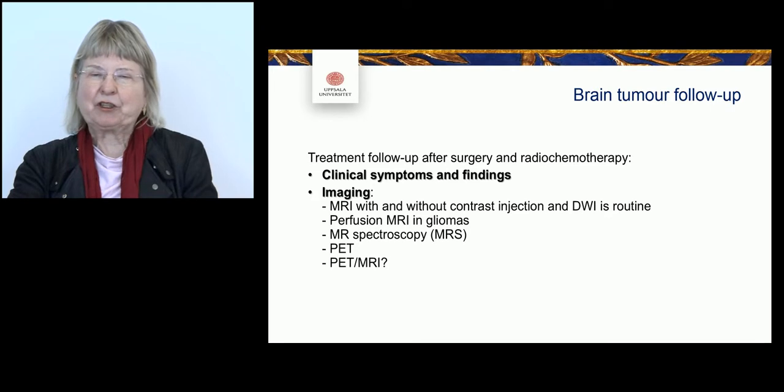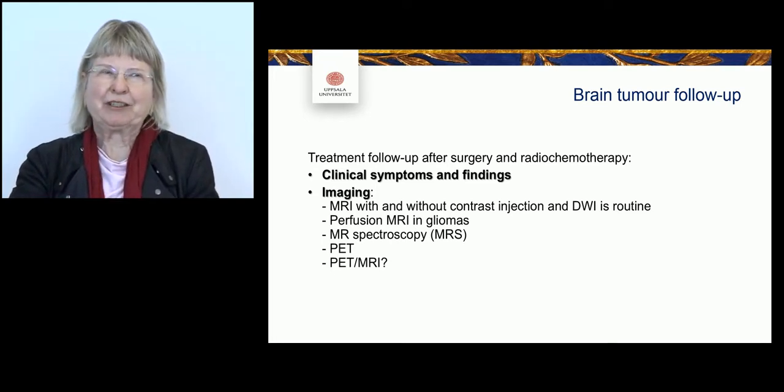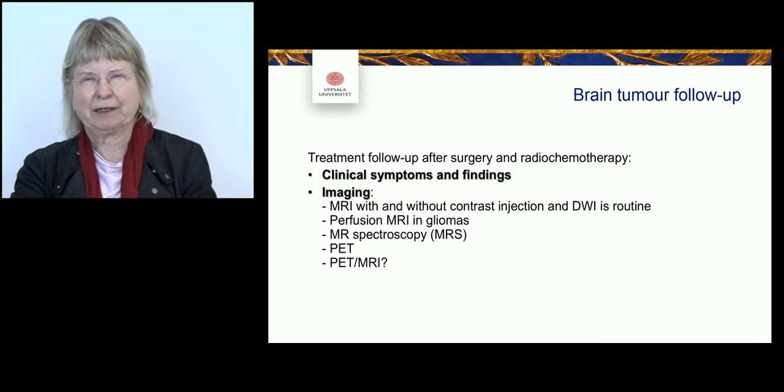Treatment follow-up after surgery and radiochemotherapy is done in patients mainly with gliomas and metastases, and the treatment can be followed, of course, with the clinician's evaluation of clinical symptoms and clinical findings, but we radiologists play also an important role because there are frequent follow-up imaging scans, and for that we use in the clinical routine MRI with and without contrast injection, including diffusion weighted imaging in the routine.